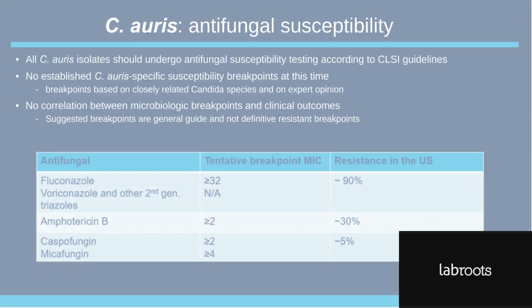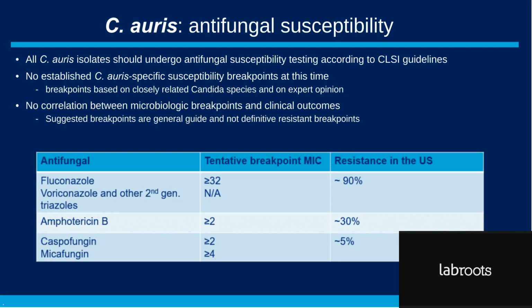As a conclusion to the review of the laboratory methods here, before I move on to my own experience with implementing this, I've mentioned a couple of times that Candida auris seems to be very resistant. So I wanted to take a minute to look at susceptibility. First of all, remember that the CLSI guidelines recommend complete susceptibility studies for Candida auris isolated from an infection. I also want to remind you that there are no established breakpoints to date, and there's no final correlation between the breakpoints and the clinical outcomes.